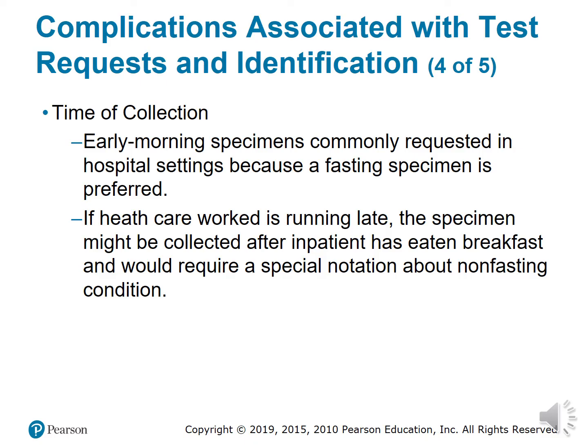Time of collection. Timed tests are important in monitoring certain medications, drug levels, and cardiac enzymes, and morning specimens have to follow a set time for the results to be accurate. If a healthcare worker is running late in collecting the timed test, the time it was collected must be documented in the patient's chart so the doctor can make adjustments to the patient's medication if needed. Say the timed test was for 10 o'clock and you didn't get to draw the patient till 15 minutes after 10, you must document that. When I say documentation, meaning we go down to the lab and say that we drew the patient 15 minutes late.